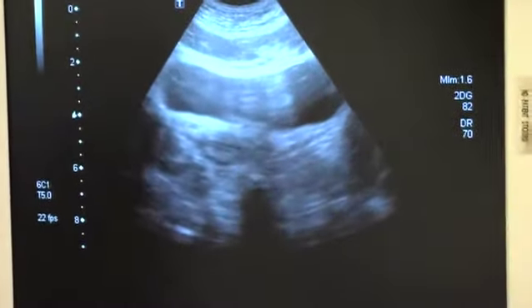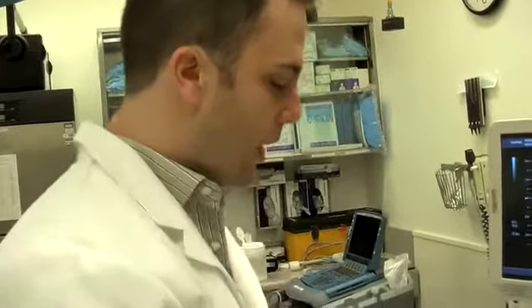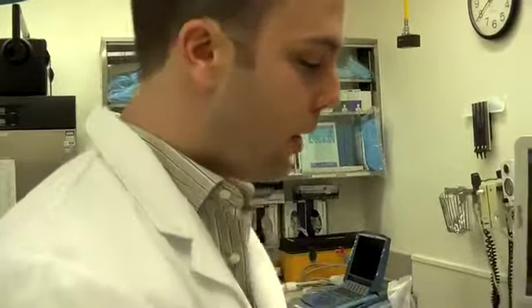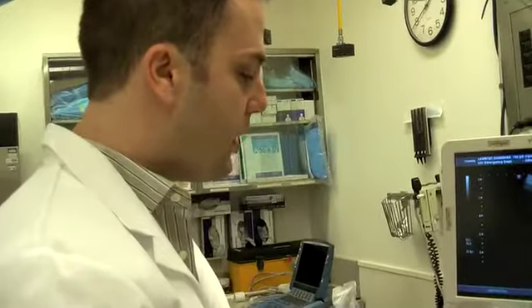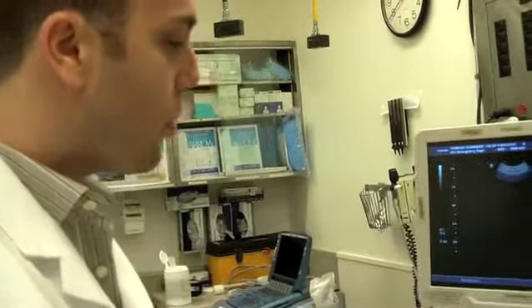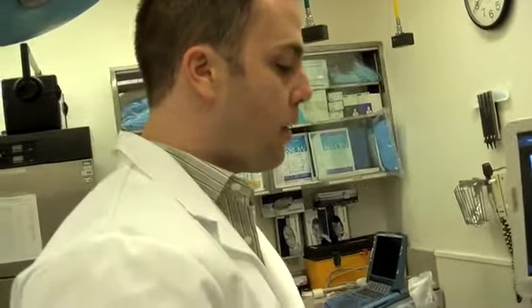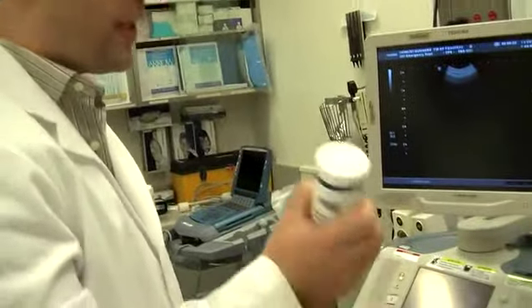Okay, so we've now extended the FAST scan to include ultrasound of the chest to exclude pneumothorax. We found in studies that the sensitivity of supine chest x-ray for trauma patients in the detection of pneumothorax is poor, especially in comparison to ultrasound. So we're now adding this as routine as part of our extended FAST scan. So I'll show you how to acquire those windows.